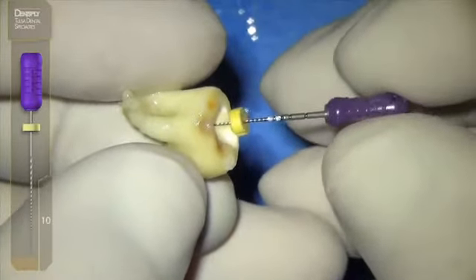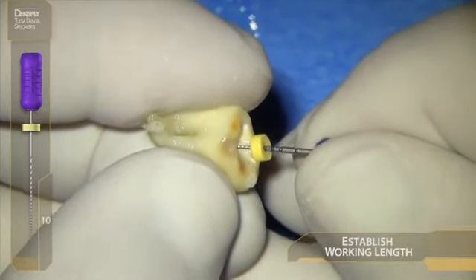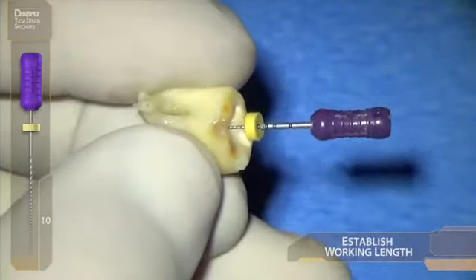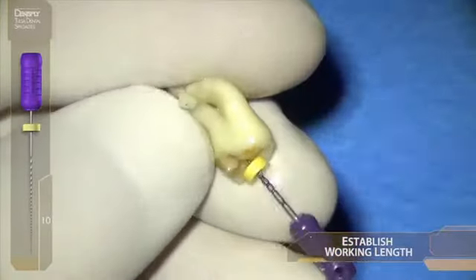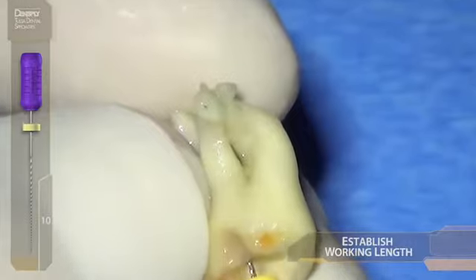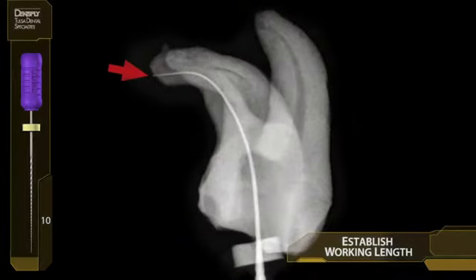pushing, we simply are able to follow easily this double S curve to the radiographic terminus, which we know is slightly beyond the physiologic terminus, which is the exact position we want to be at to make a glide path, because we want to stay patent. Otherwise, the apical area will be clogged and will be short of the mark. Radiographically, we can see clear evidence that the file is beyond the radiographic terminus and can be further validated by the apex locator.